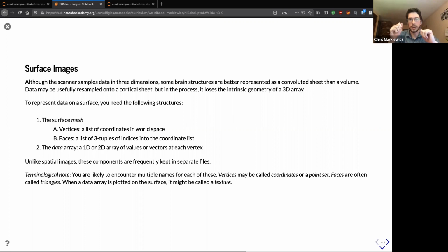So a good example is, two sides of a sulcus might have a long distance between them, neuronally, because the information has to spread by neural tissue. But if they're pushed up against each other, you might get a blob that looks much as if the activation in one is similar to activation in another. So how do we talk about surfaces then?